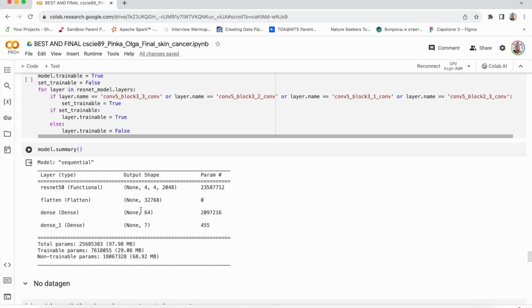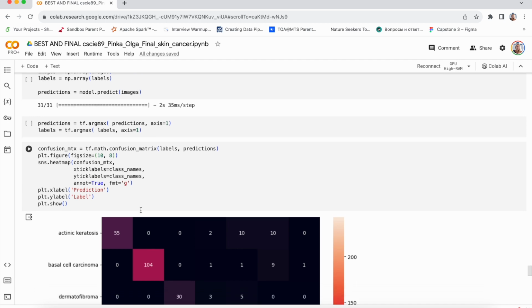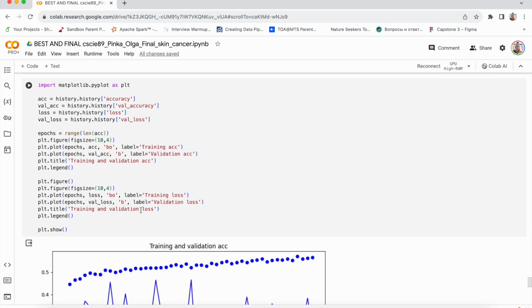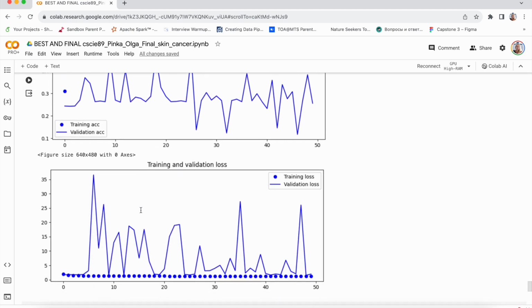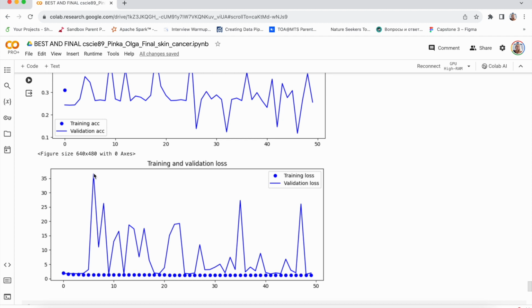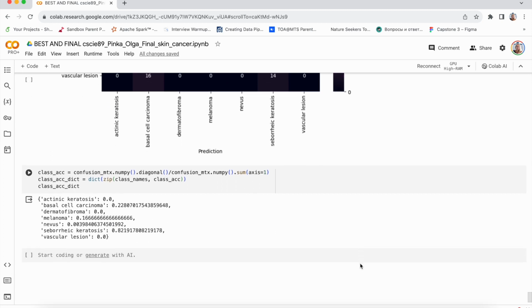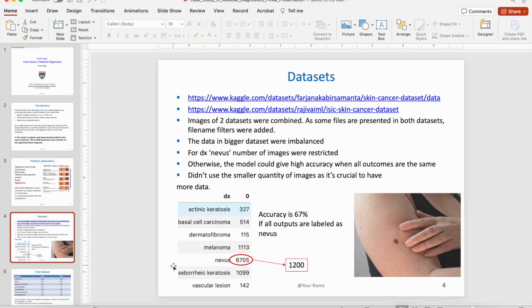It gave me a good result, but it was not better than the Xception model. But with the data generator, it gave me a strange result. The model was diverging after 5 epochs here, and it did not come back. So it was the worst result. Probably this model is not suitable for skin cancer detection.